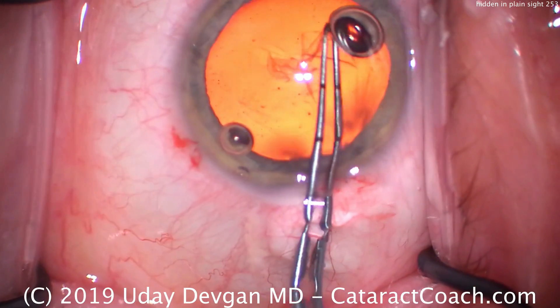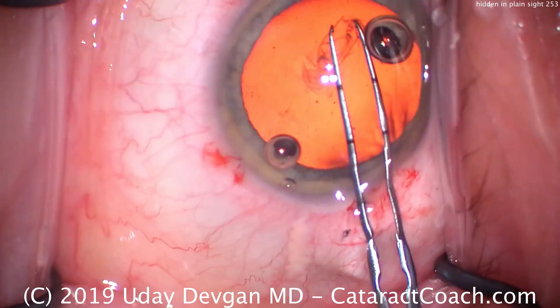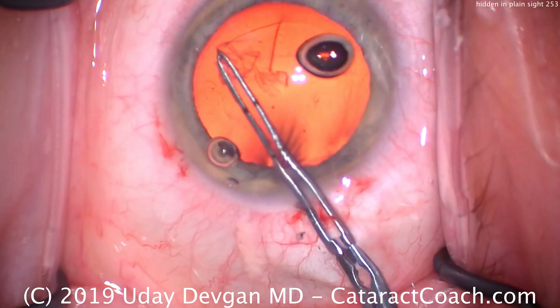And here comes the capsulorhexis. That's completed without any issue at all. Nice, continuous, curvilinear, appropriate size, appropriate positioning. Everything looks great here.